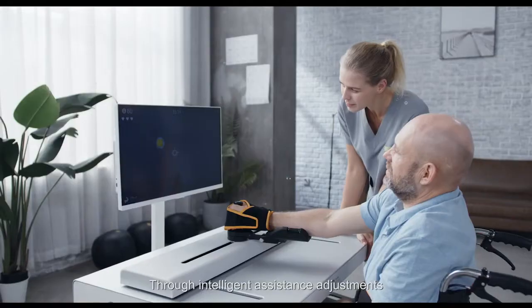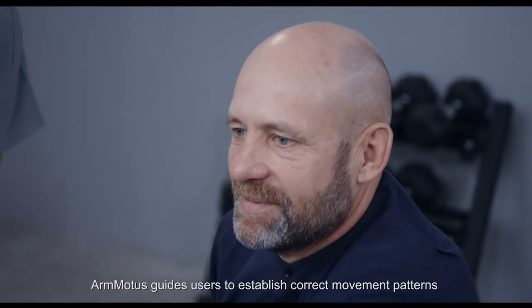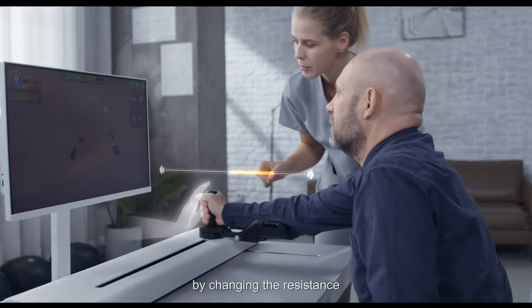Through intelligent assistance adjustments, ArmModus guides users to establish correct movement patterns in the early stage. Late stage rehabilitation needs can also be met by changing the resistance.